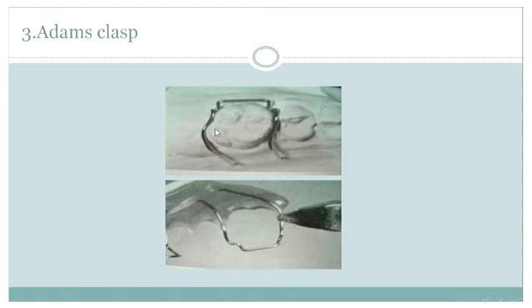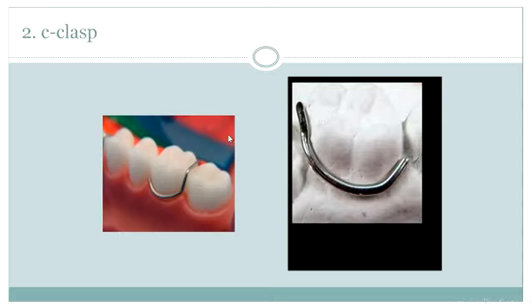Sometimes we use a double Adams on the 5 and the 6, or on the 6 and 7, according to the need of the dentist.